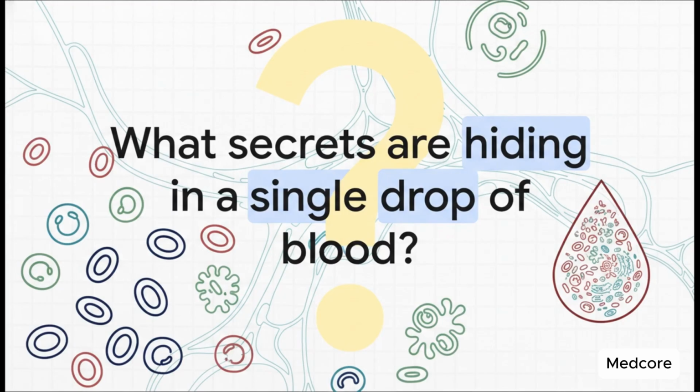Just think about that for a second. What secrets are hiding in a single drop of blood? A peripheral blood smear isn't just a bunch of cells on a slide. It's a rich, detailed story about your patient's health. And our job is to learn how to read that story.